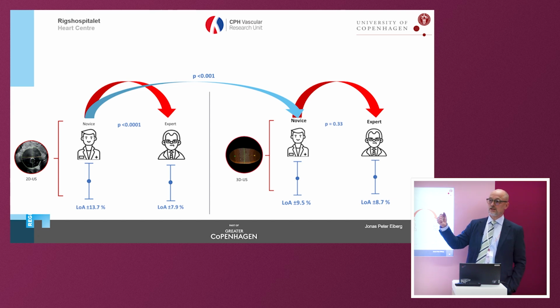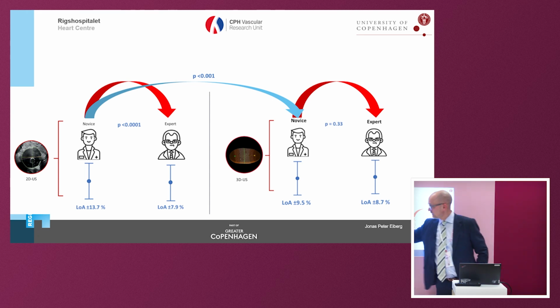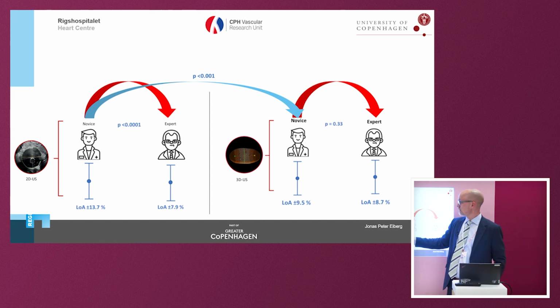They have tried to image a bowel or the vertebra or something strange. But the system was able to correct it. And they were not allowed to see the reconstruction, because we wanted to avoid that they were guided by it.